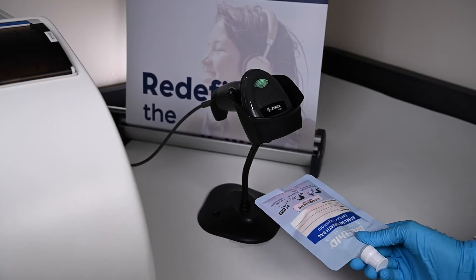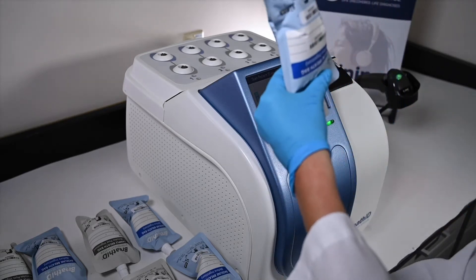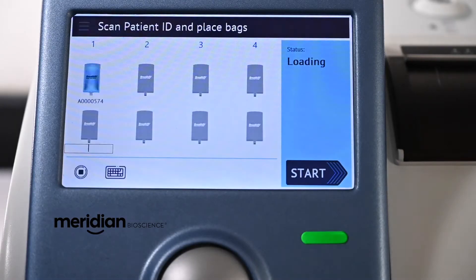First, the user scans the blue baseline breath bag. The auto sampler on the top panel of the instrument has indicator lights located at each port. The matching indicator light will illuminate and an image of the blue bag will appear on the screen at pair one if the bag was inserted correctly.